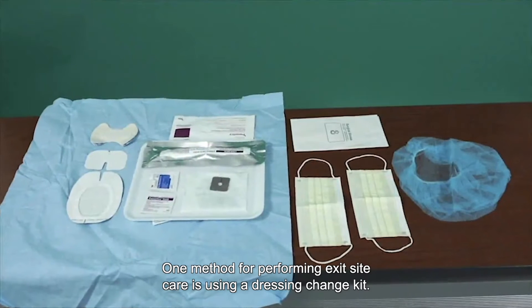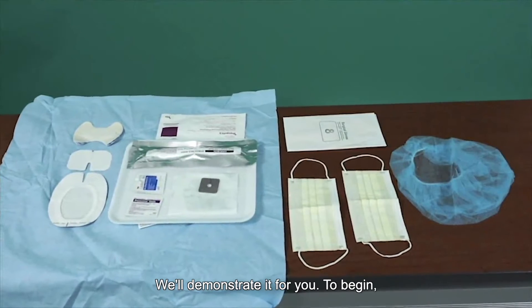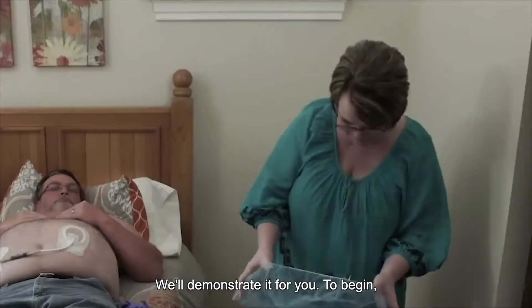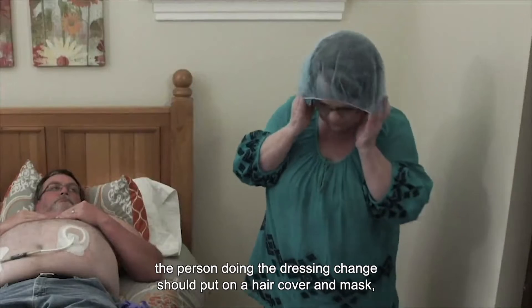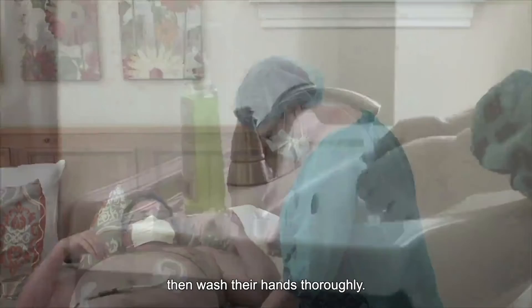One method for performing exit site care is using a dressing change kit. We'll demonstrate it for you. To begin, the person doing the dressing change should put on a hair cover and mask, then wash their hands thoroughly.